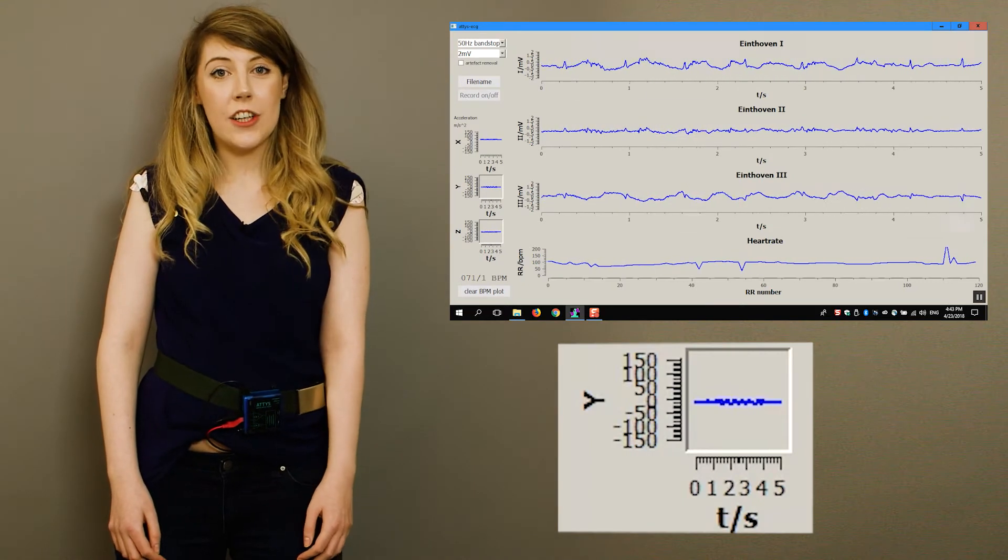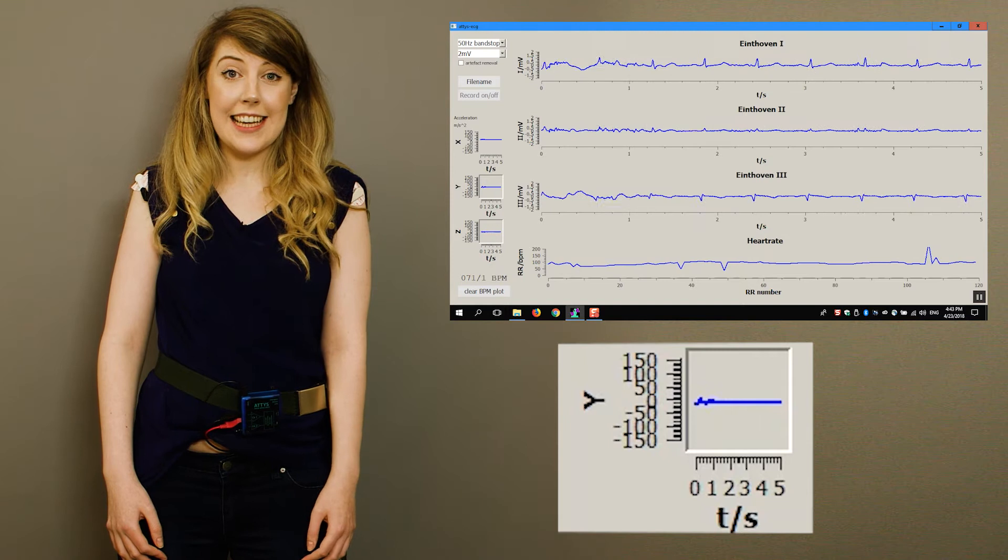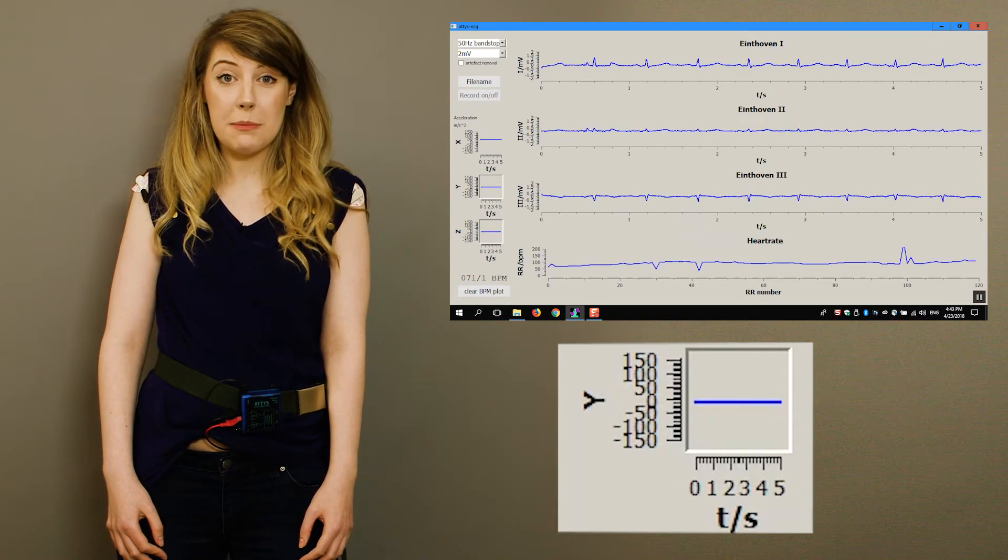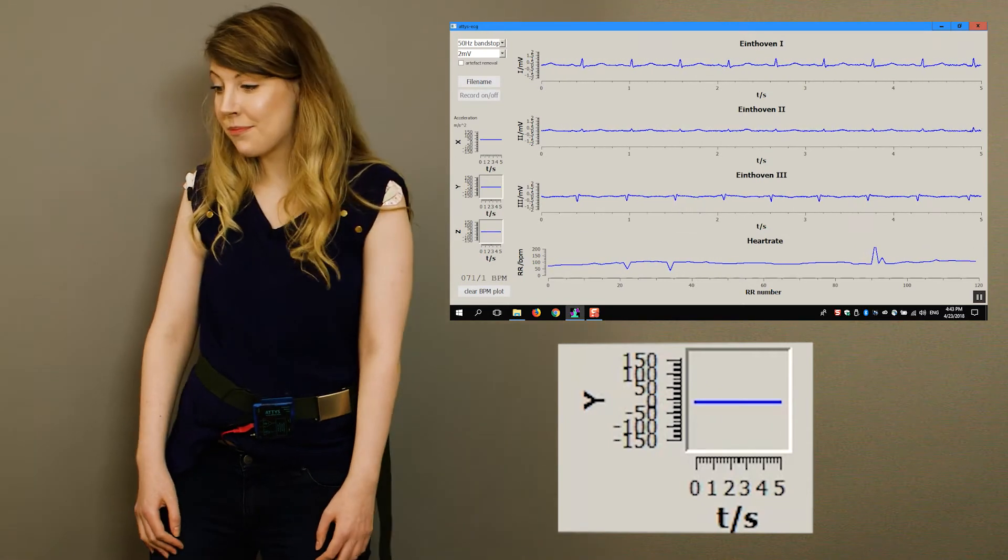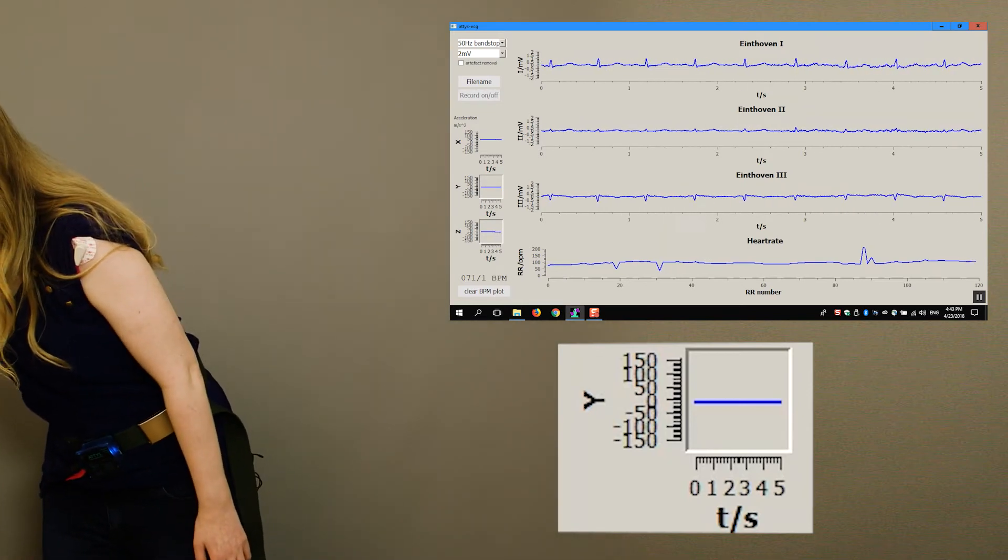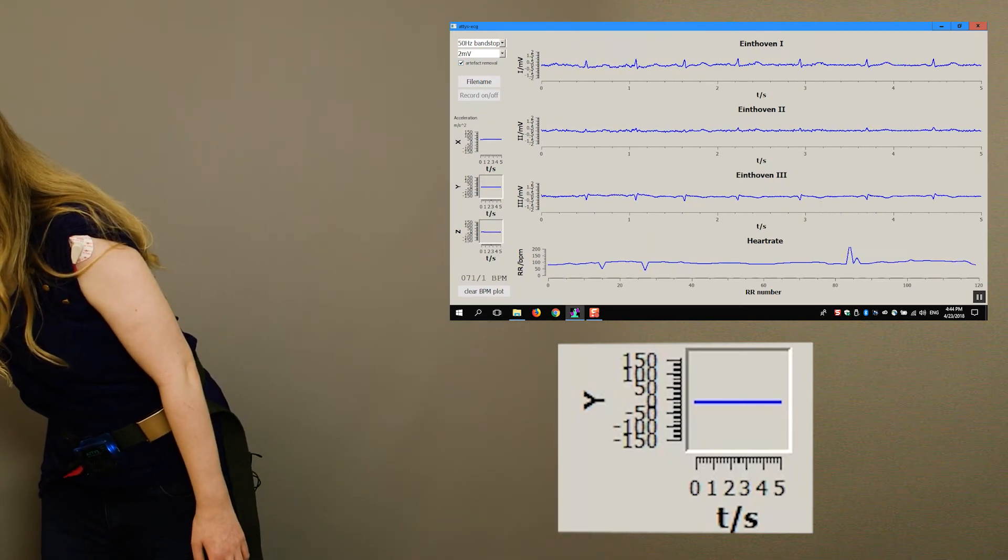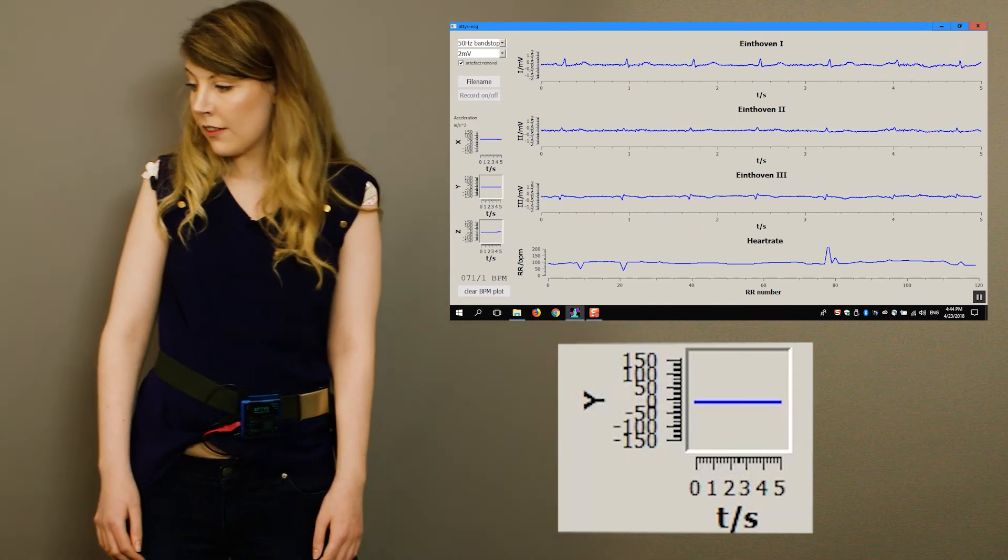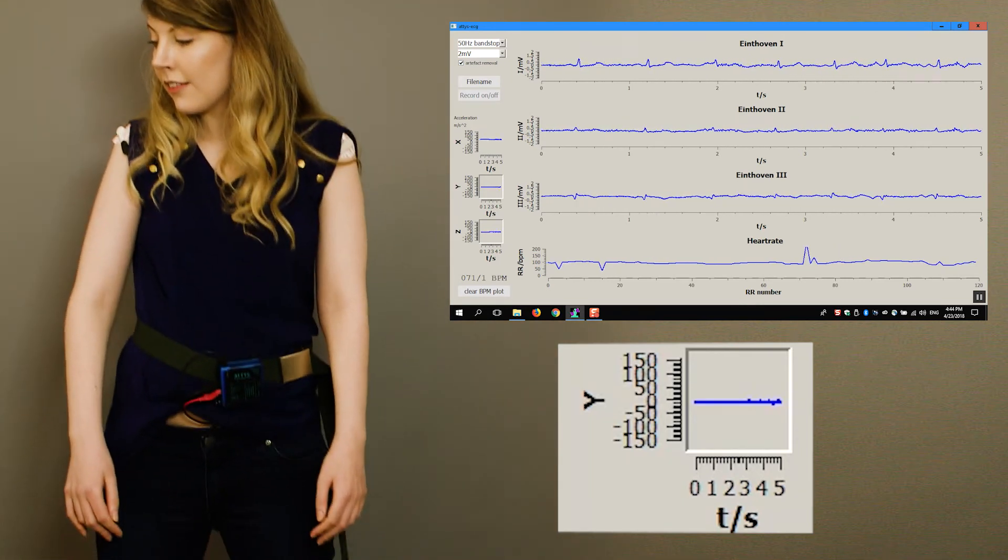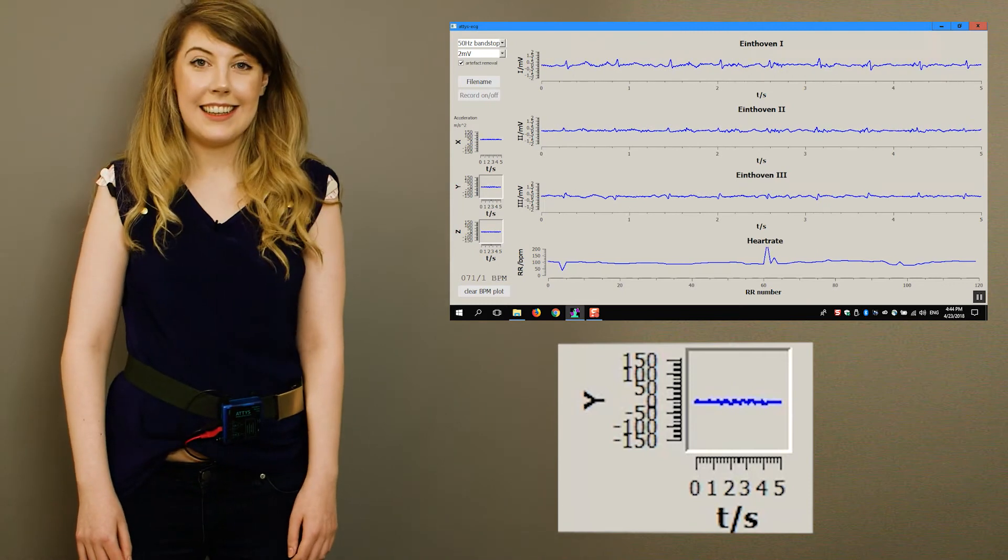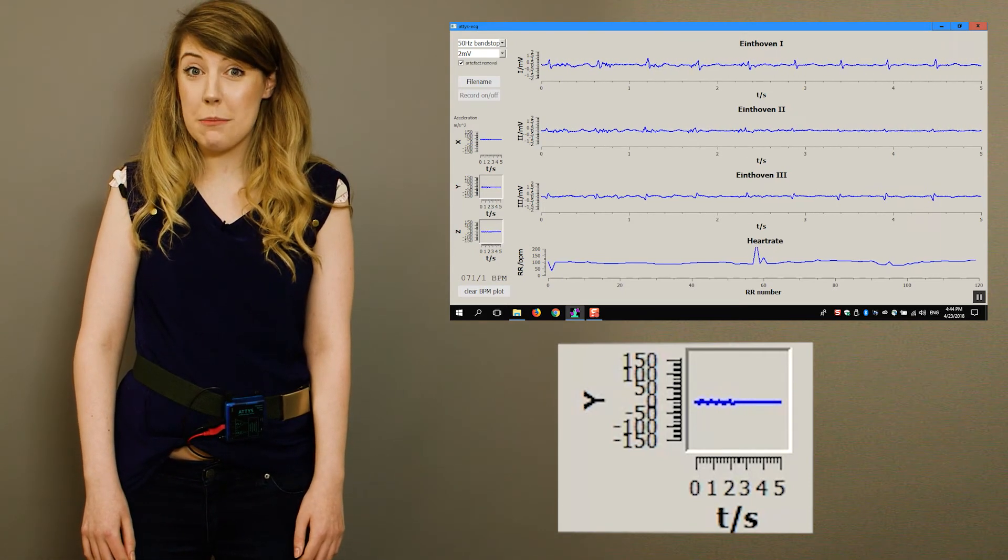The accelerometer registers this and so we just need to send it to a smart algorithm and tell it to reduce my movement artefacts. The algorithm learns whilst I move.